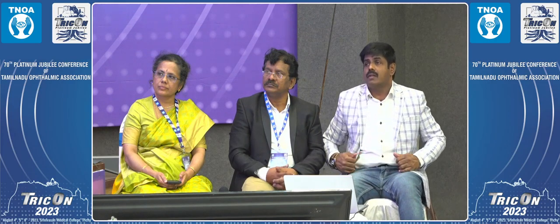It's not a fixed size. This is Dr. Mohan Rajan's chopper, which I bought from Appasamy. It is catalog number 1989, I think, and you have an A, B, and C. A is 1.25 millimeters, B is 1.5, and C is 1.75. I have all three. If it's a grade 2, I generally use the A or B chopper, and if it is a grade 3 plus, I use the 1.75 millimeter chopper.